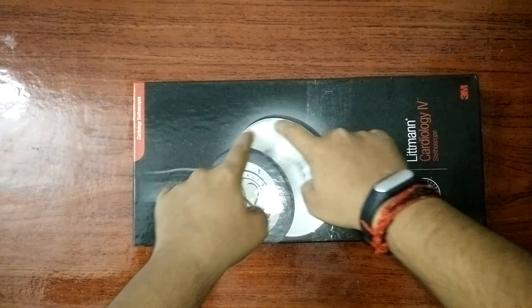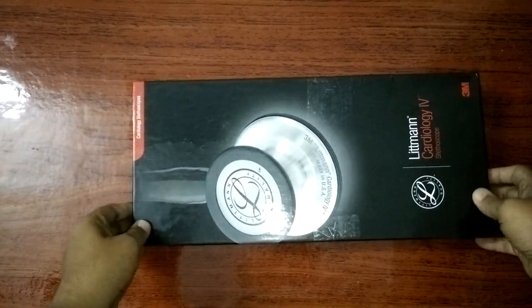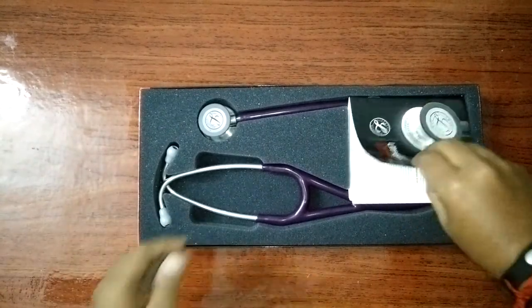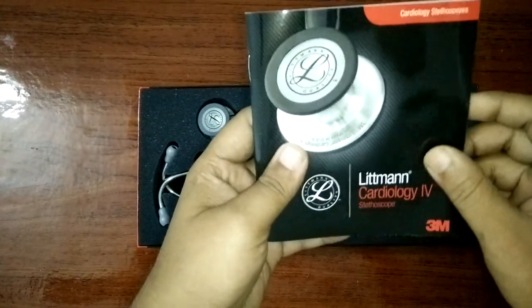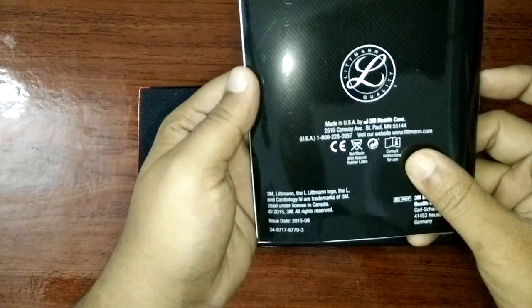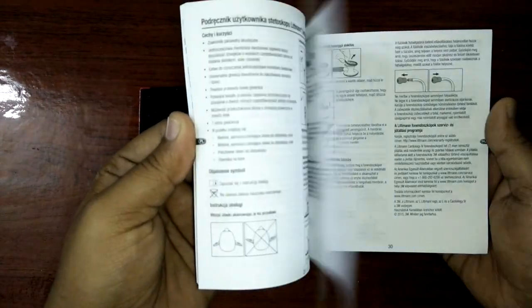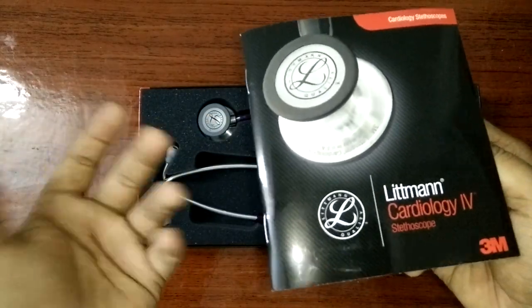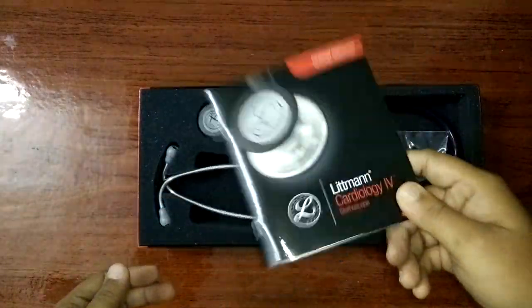It looks very big. Let's open it up. We got a user manual instruction kit — made in USA, 3M Healthcare. A lot of things to read but I'm not going to use it.